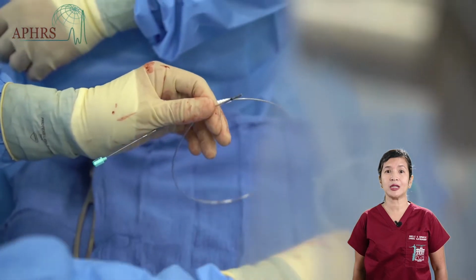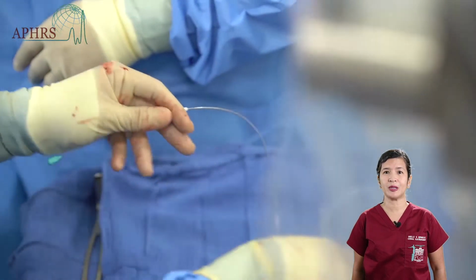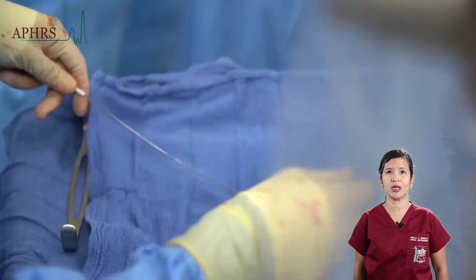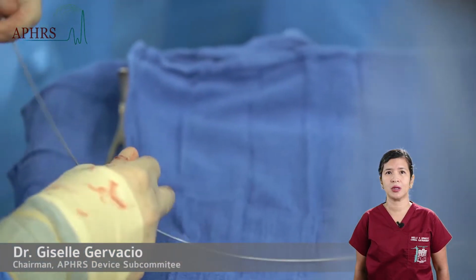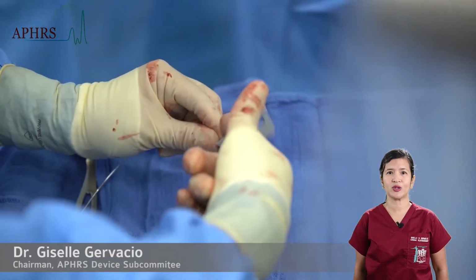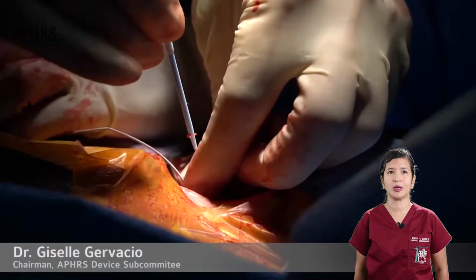The lead is physically examined, checking for completeness of the parts. The screw is exercised by turning the pinching tool attached clockwise several times until 2.5 screw coils are visible.